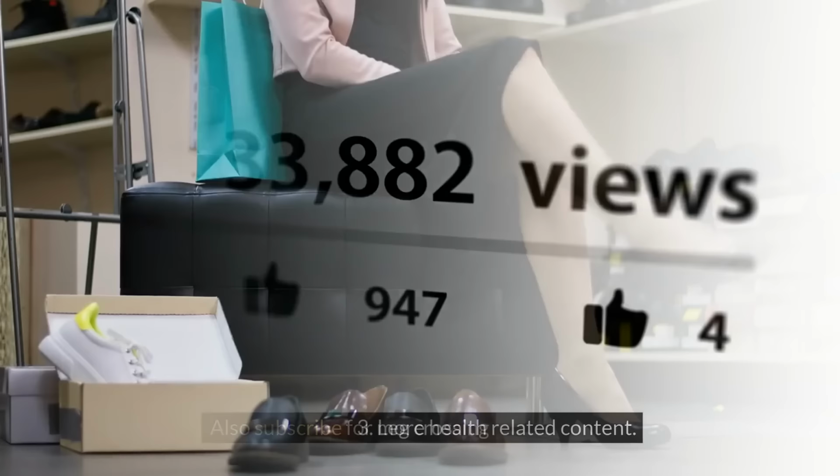1. Placing cuff over clothing. Placing the blood pressure cuff over clothing is incorrect because it can interfere with the cuff's ability to properly detect and measure blood pressure. Clothing creates a physical barrier between the cuff and the skin, preventing the cuff from making direct contact with the artery. This barrier can cause the cuff to not inflate properly or distribute pressure evenly, leading to inaccurate measurements.